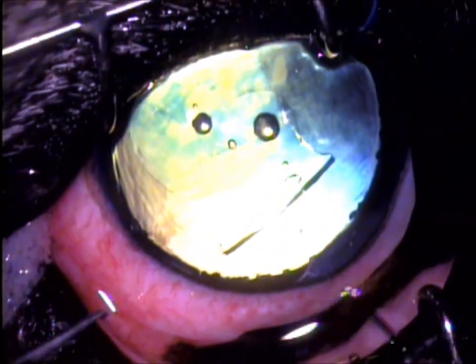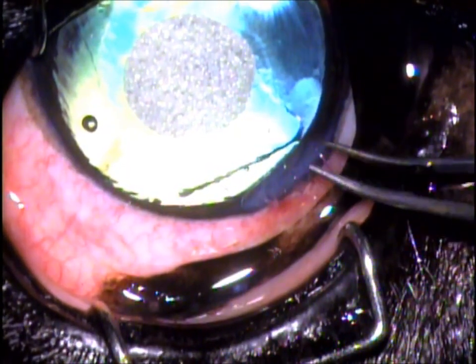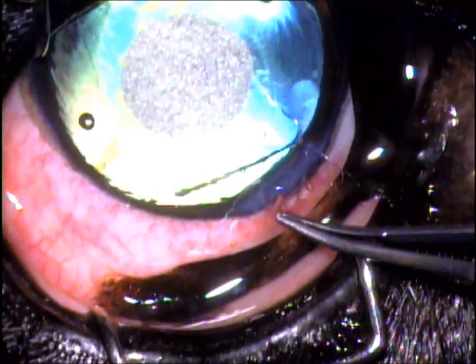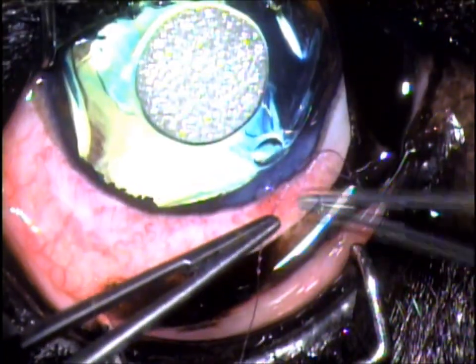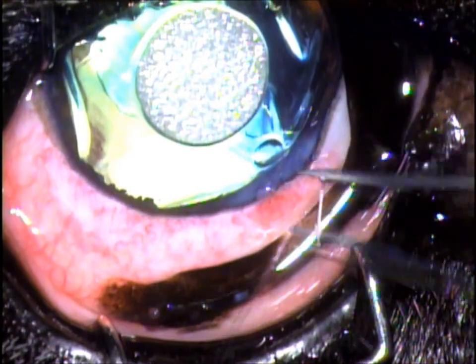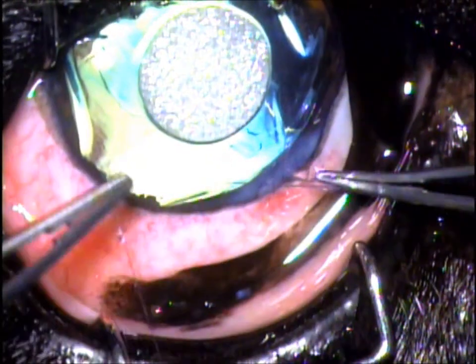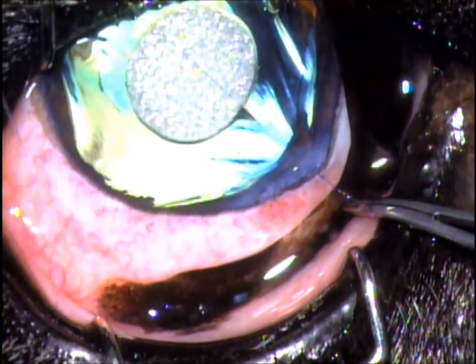You can see it unfolded. We're now just going to position it, make sure that it's in the center of the eye, so that the clear visual axis will be present. The lens has gone white again because of a much brighter reflection from the back of the eye. I put a white circular thing on the cornea just to protect the retina from the very bright operating microscope light. And here I'm getting the sutures finished — suture material thinner than a human hair to tie up that three millimeter incision. Then we reinflate the globe, and Zsa Zsa's cataract surgery is done.